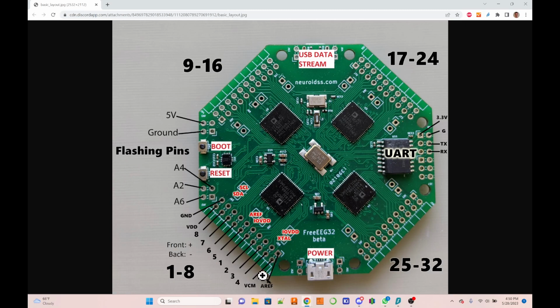All right, so just to clarify, here's the VCM pin that we have just discussed at length, which I think is clear now. So these blocks of 10 by 20 connectors, they're the same everywhere. So VCM is here. If you turn this thing clockwise, this will be VCM, and this will be VCM, and this will be VCM. So it's not mirrored. It's just turned 90 degrees every time. That's how this works. So VCM is over here, and VCM is over here, and here, and here.